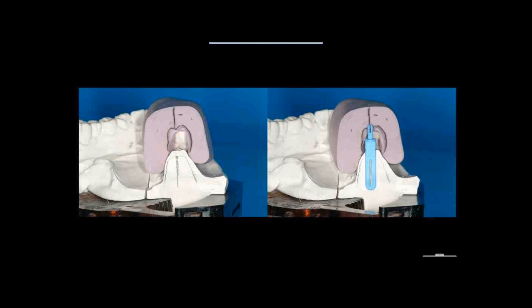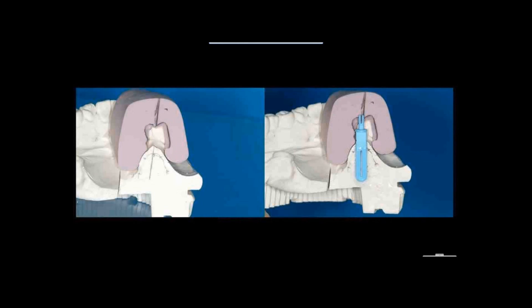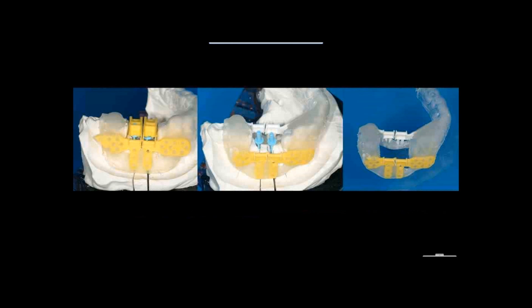I'm doing that also for the other tooth and putting everything together. Now you can see I have a relatively tight situation — not crazy — but the 3D click guide system allows you to automatically get the right distance between the dental implants: three millimeters between implants and a millimeter and a half from the neighboring tooth.